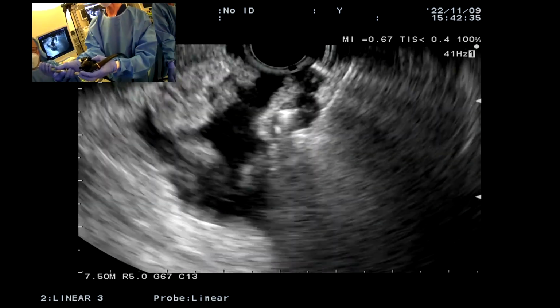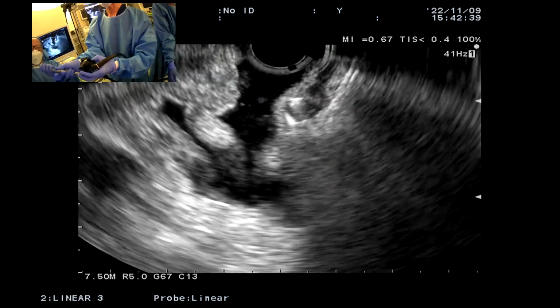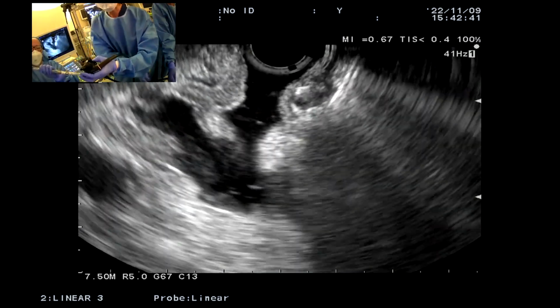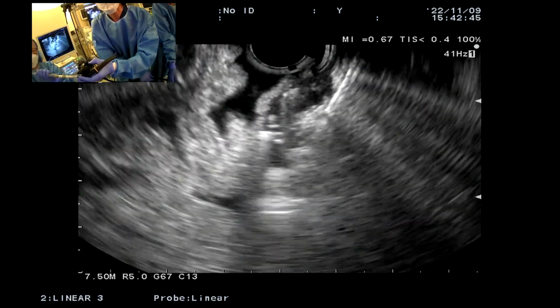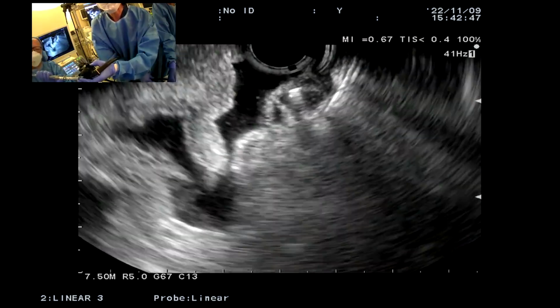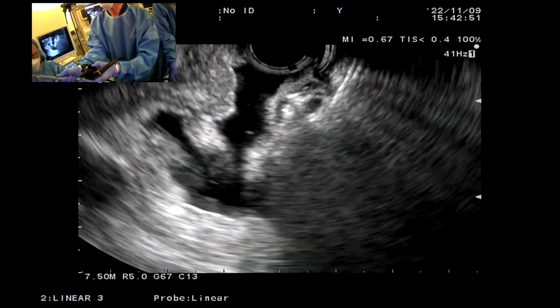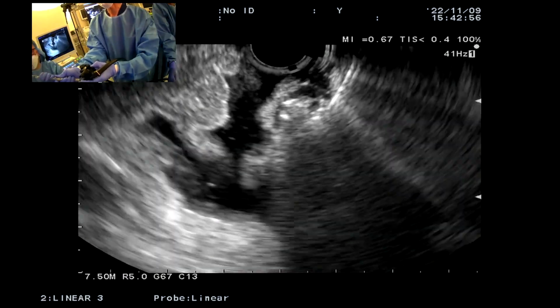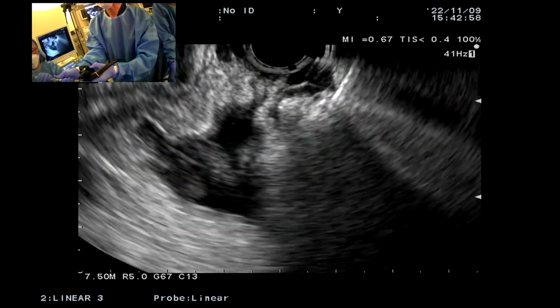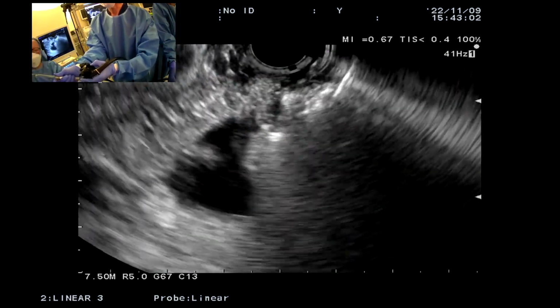And you'll lose visualization. That's why your assistant has to hold everything very, very carefully and make sure that we don't slip back. Then try to adjust just a little bit here. Just pull just a little bit. Yeah, hold that. Okay. Keep flushing. Two of them went in. Okay, good. Now as she flushes, I'm going to start pulling back slowly. Tell me when the dead space is in. Everything is in. Good, I'm pulling this out now.